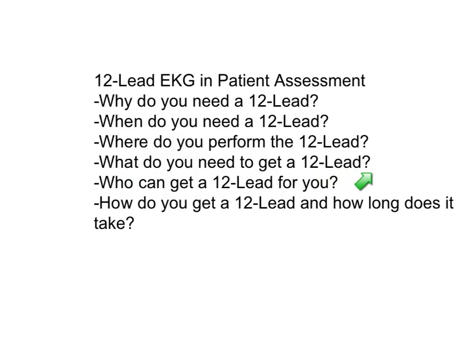Who can get the 12-lead for you? Well, certainly any paramedic can get the 12-lead for you, and your EMT partner if you're working on an ambulance service. The EMT partners should be able to get those. Now realize that many EMT programs aren't teaching 12-lead acquisition as part of their curriculum. Well, we do, and we're also teaching it in our continuing ed. So our hope would be that many of our firefighters and all of our EMTs would be able to assist with that.